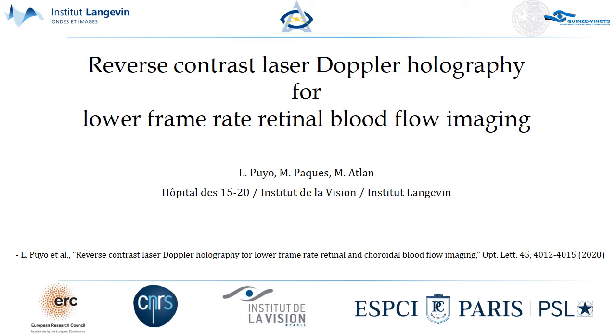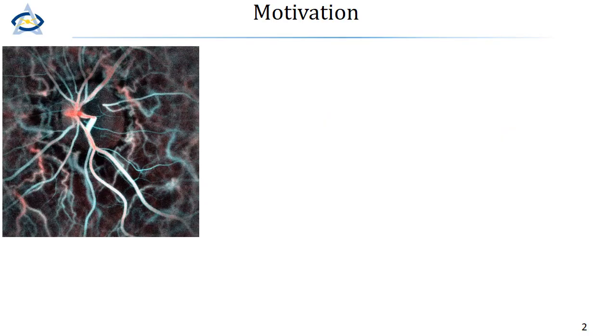This presentation is to describe the concept of reverse contrast that we've recently introduced in Doppler holography to be able to perform retinal blood flow imaging at a much lower frame rate than before. The motivation for this is quite straightforward.